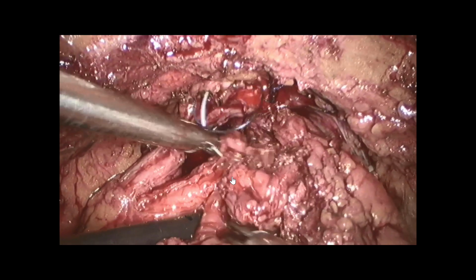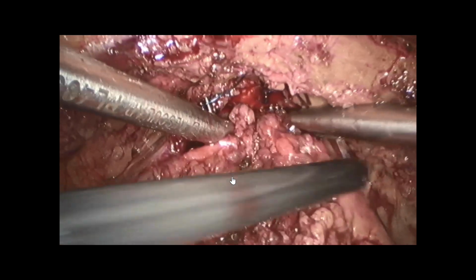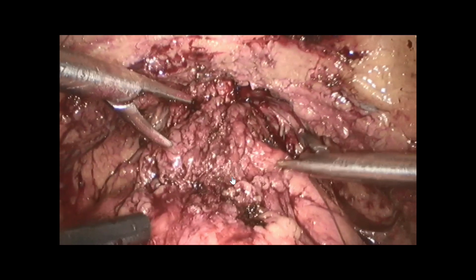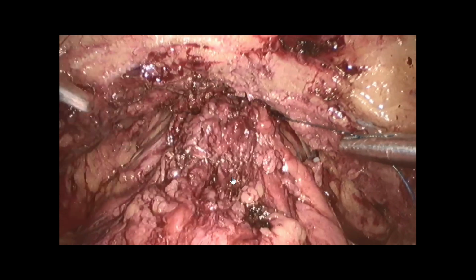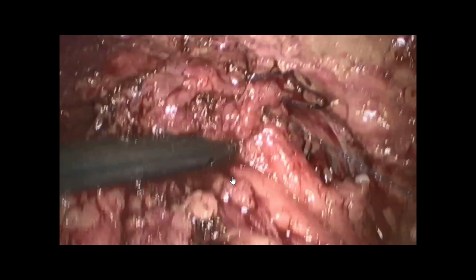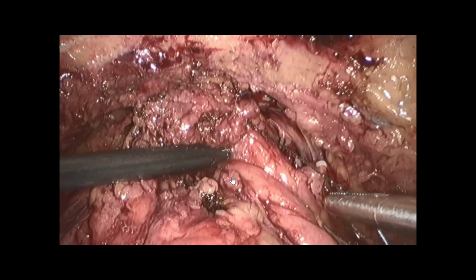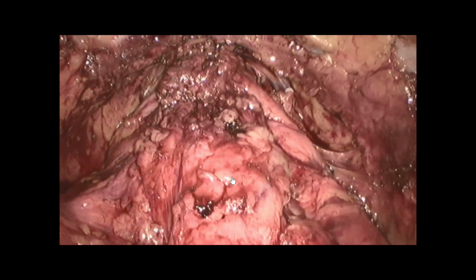And you see at the end, I refix totally the bladder anteriorly to have a perfect fixation medially. And then, for me, all these small tricks help. Now I used to place some hemostatic agent like Arista powder in the bed at the end of the surgery. I don't leave any drain, and it's over.